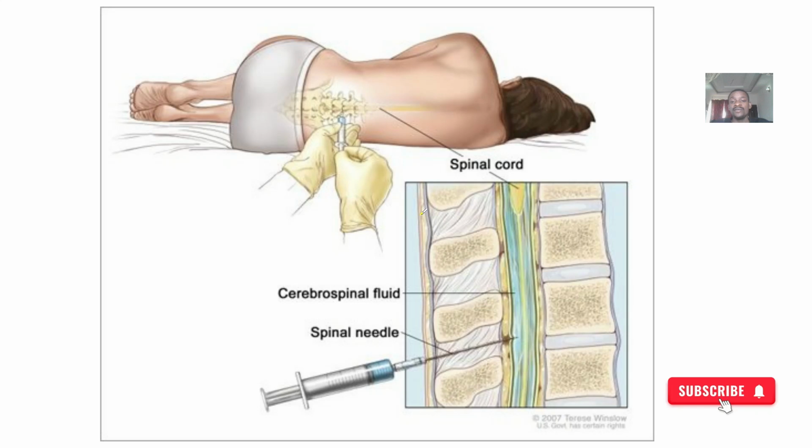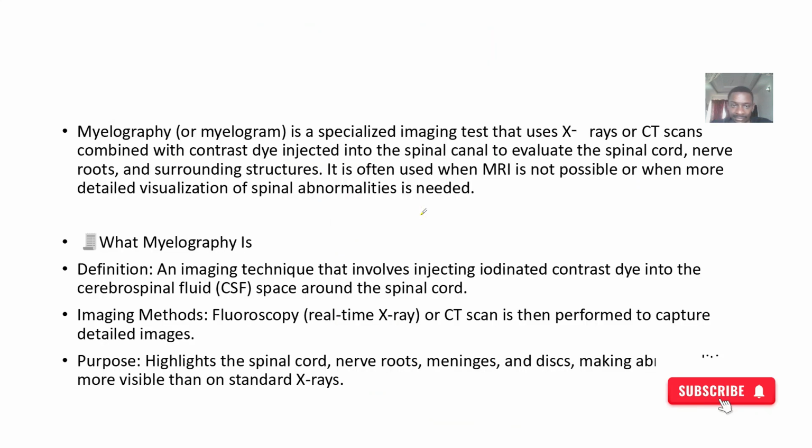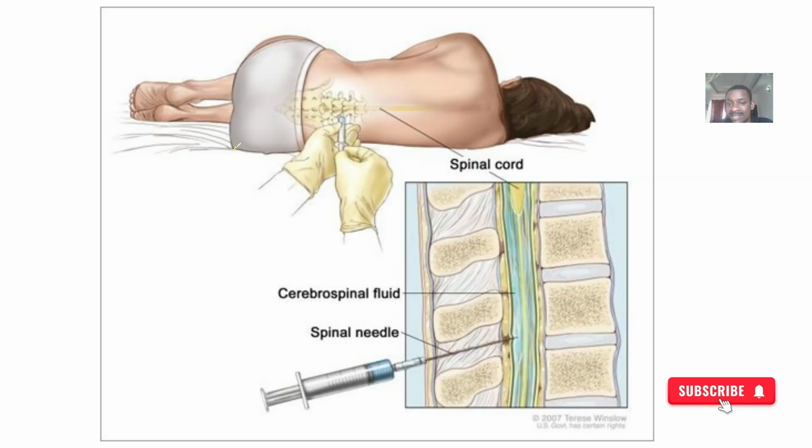So myelography is also known as myelogram. Alright, so it's a specialized imaging test and uses X-rays or CT scans, which are usually combined with contrast dye. The dye is this thing that they're actually injecting here.